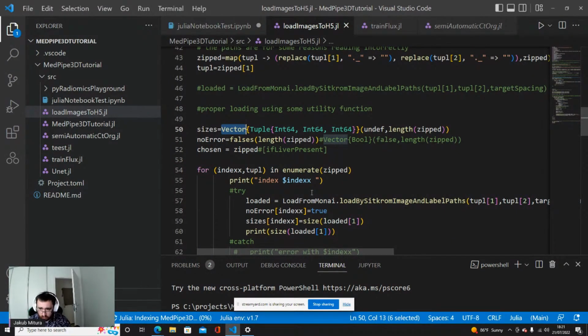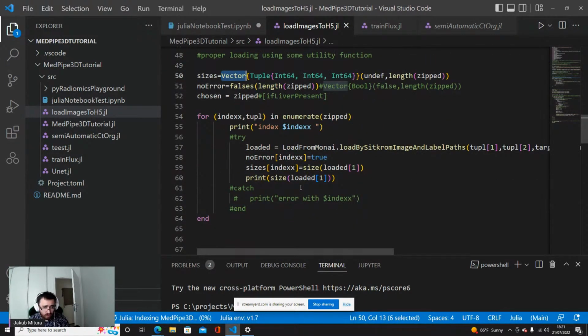Because the neural network expects the same dimensions of the arrays that are put into it. So in order to put the array as the argument, as the training sample, it needs to have exactly the same dimension as all of the other arrays that we put.